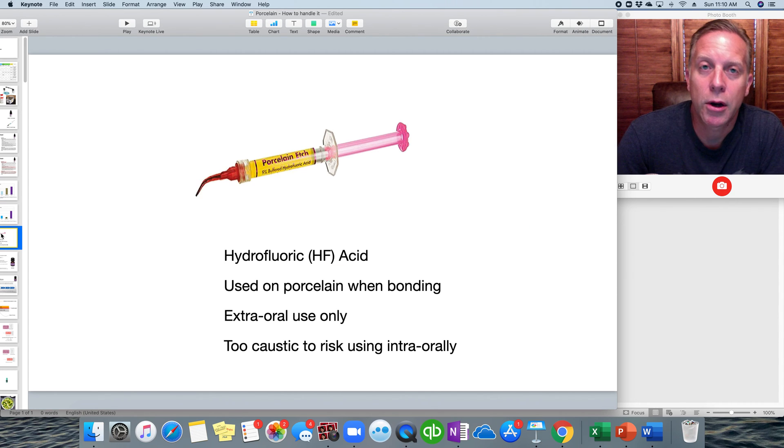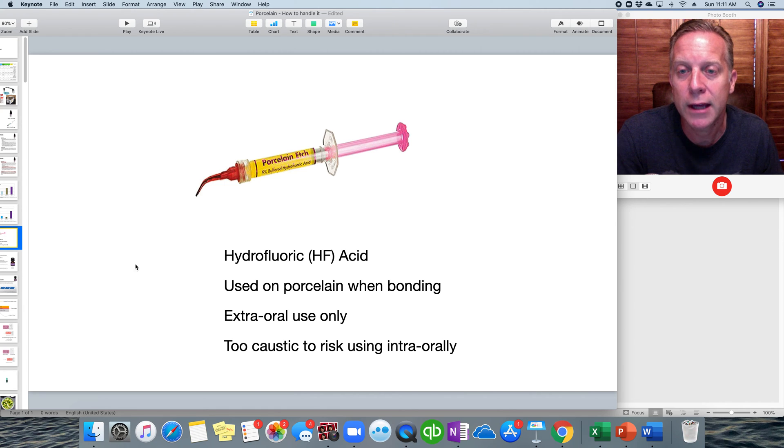The next step, if you're going to be bonding using a resin cement, is hydrofluoric acid — HF acid. This is used when porcelain is being bonded, such as with veneer cement or resin cement. You don't need it if you're using a traditional cement like resin-modified glass ionomer; this is specifically for getting a restoration ready for bonding. We only use HF acid extraorally — not intraorally. It's too caustic and poses risk to soft tissue and the tooth itself, so we will not use it for intraoral porcelain repair.